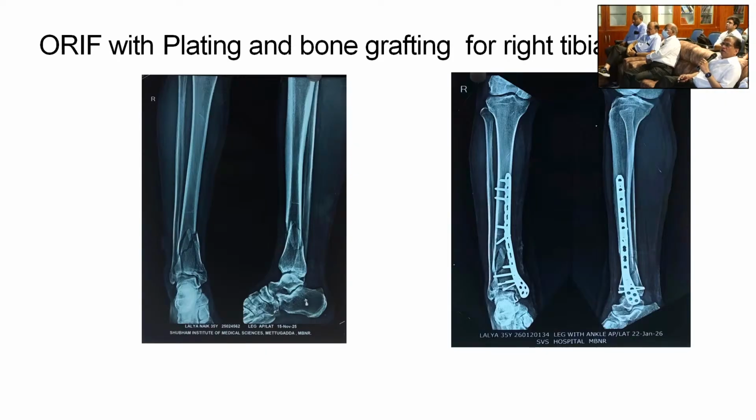That's the principle of intra-articular fractures with the diaphyseal extension. And there is no fixation on the lateral side. No stability. As Dr. Anjaneyulu said, Sarmiento would have been better than this fixation. Okay, we'll discuss this one later. Okay, go on.